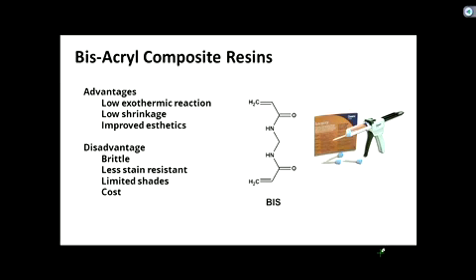In the video, we reapplied the flow at the end. Yeah. Built up a little margin. Is that the same? In that video, when he had to readjust it after he took it out the original time, one of his margins was messed up, and he had to add flow. Was it the same thing, or was it the other thing? Different thing. The one we would use for filling? Yeah.